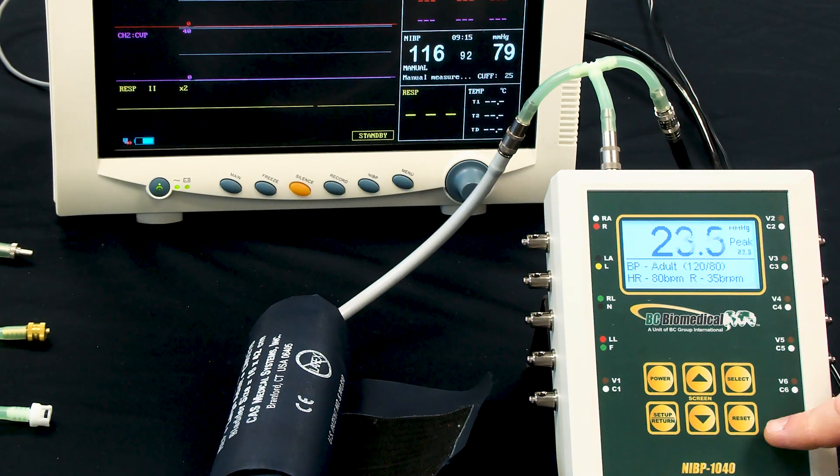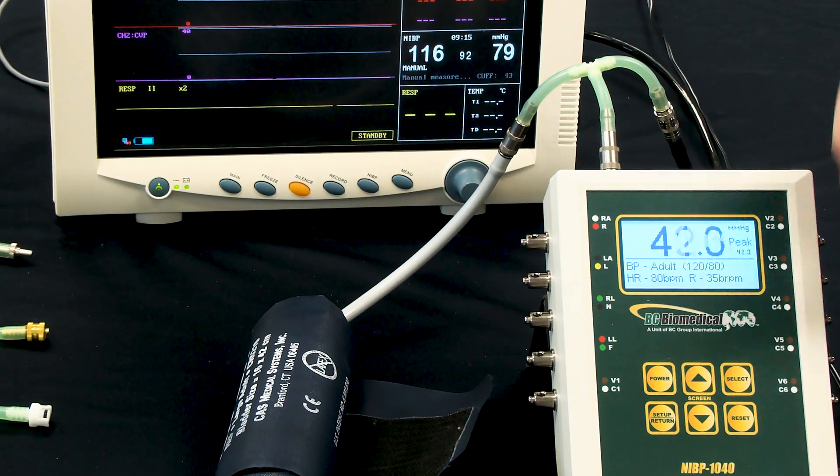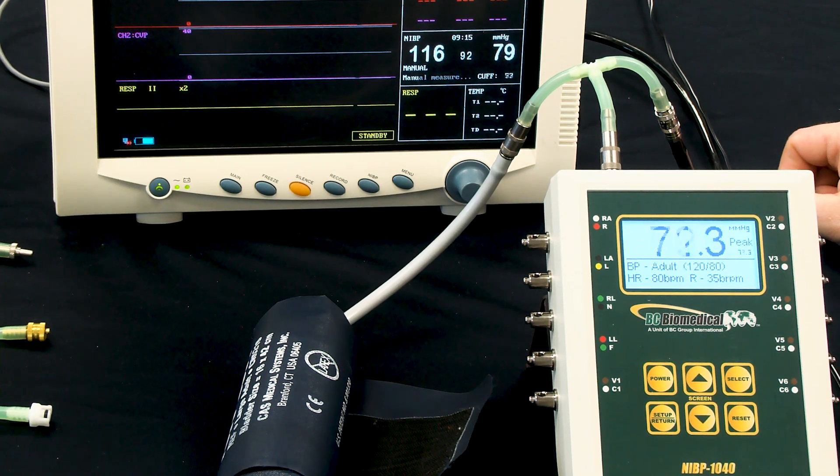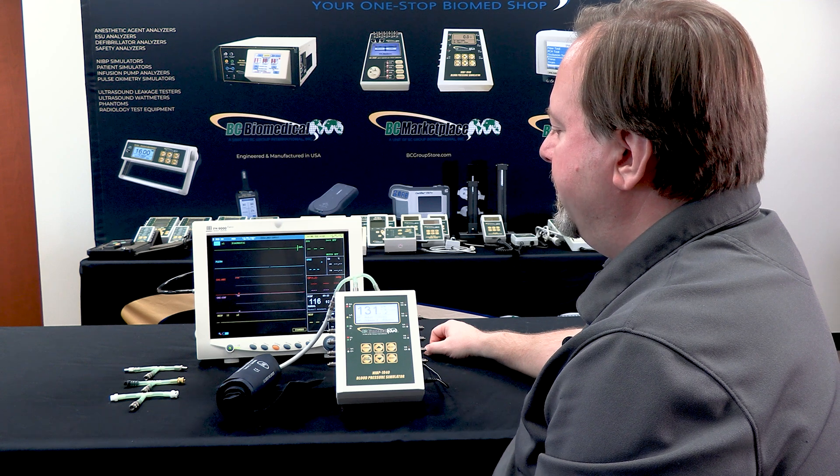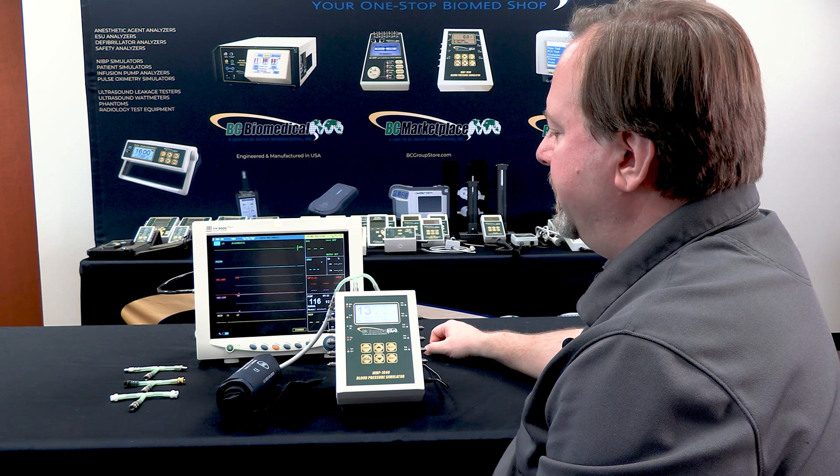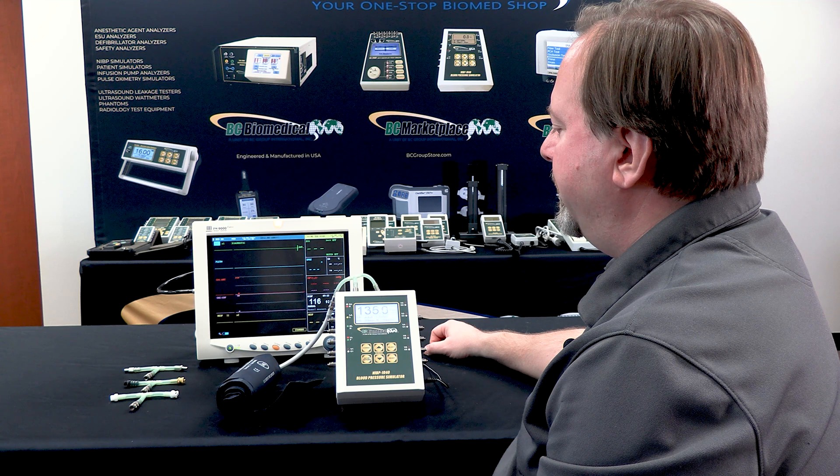So just to make sure that now we're at a stable state, to reset the peak pressure, all I have to do is press the reset button on the NABP 1040, and that will reset that reading. And we'll allow it to get a measurement again and we'll see what it comes up with.